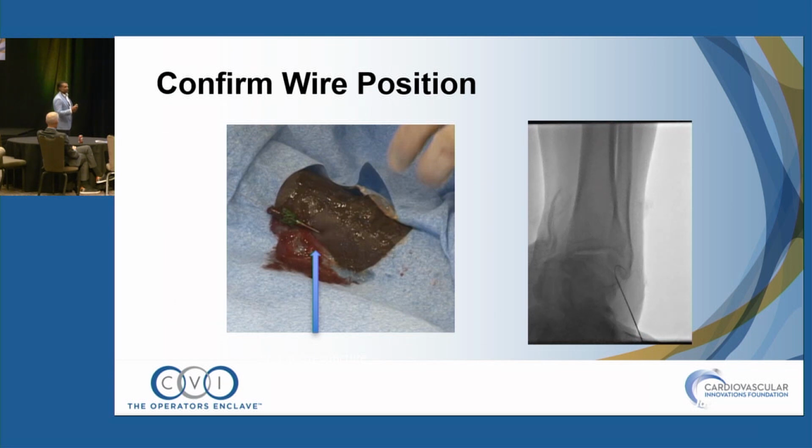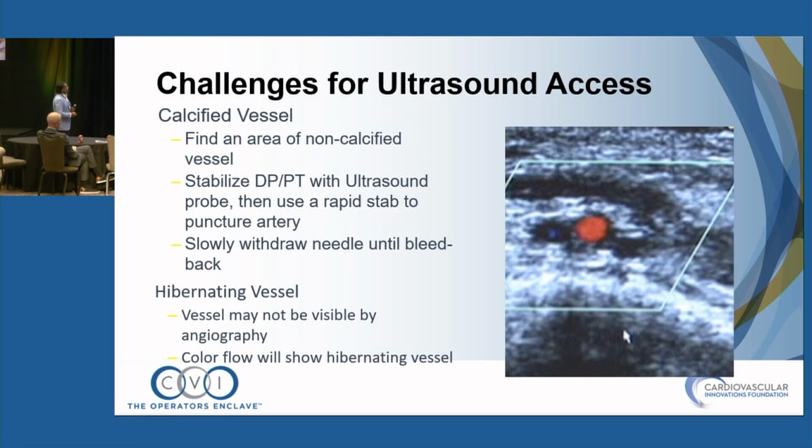And sometimes you go through and get it on the way back. So that's what it's going to look like. You're going to confirm wire position, as we mentioned before, and then move forward. So let's talk about some challenges, some tips and tricks for challenges. Probably one of the biggest challenges that you're going to see.